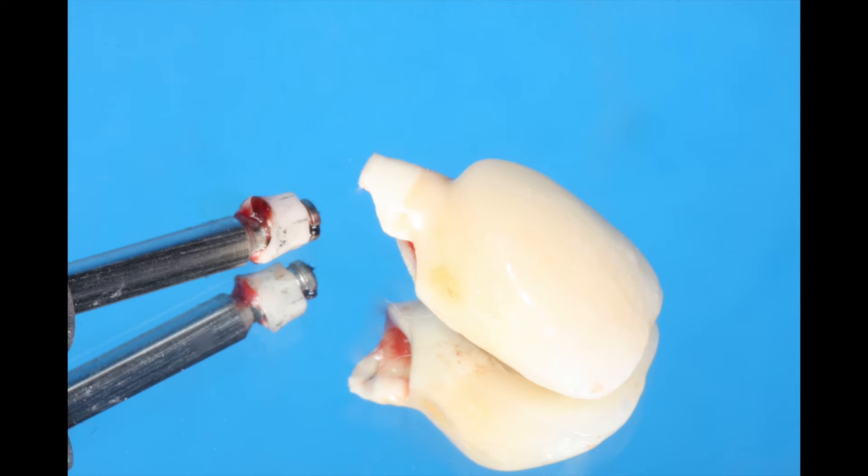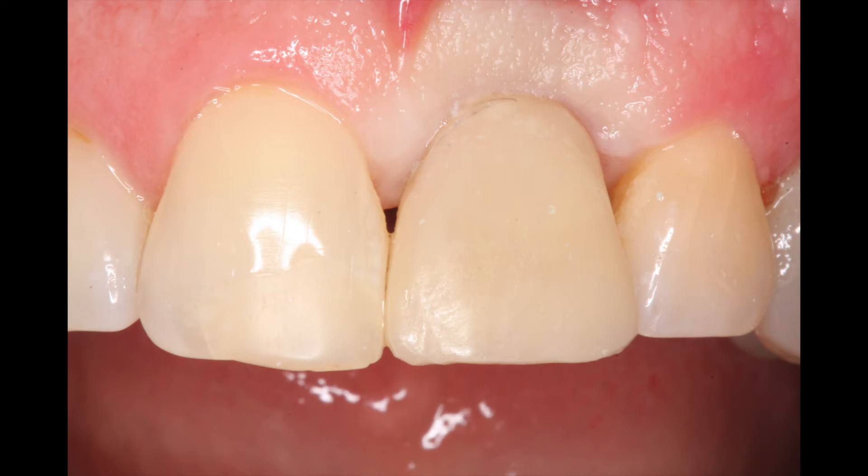This is typically what broke the older style full zirconia abutments with porcelain over top. We made an 8-minute temporary, which I do show you how to make in a course. You can come to a course — we're training at handsontraining.com and you can learn how to do this.